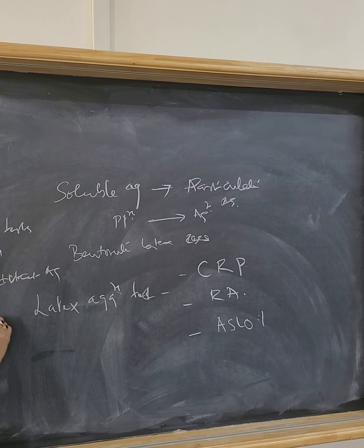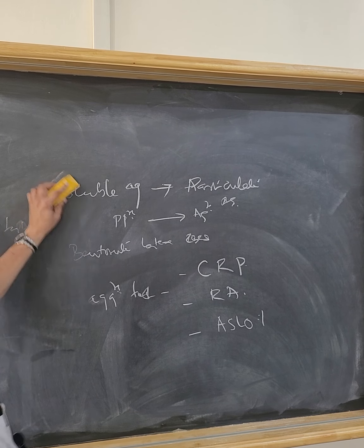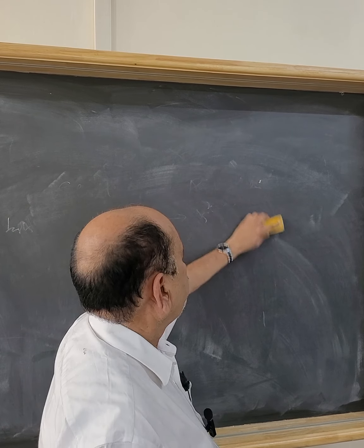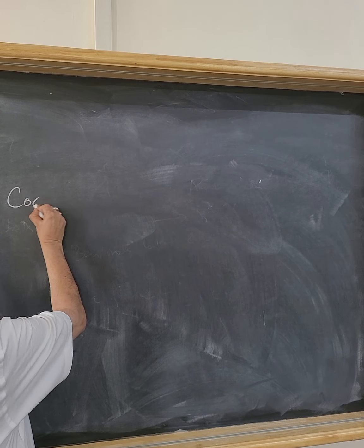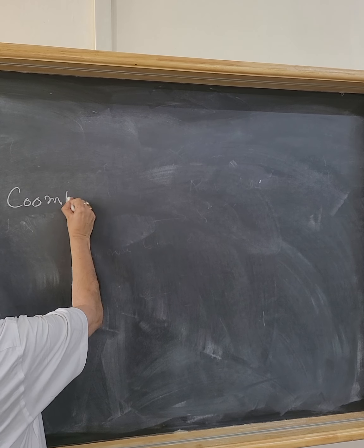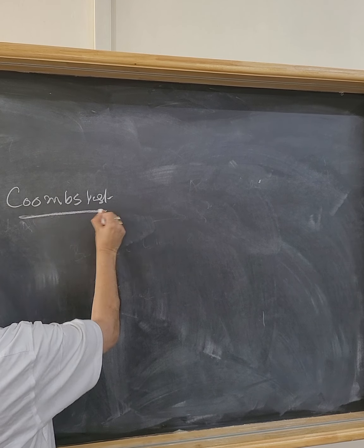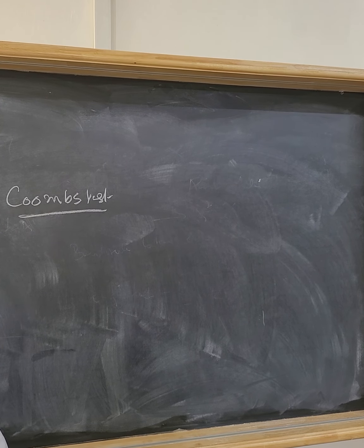The very important agglutination test we do in day-to-day clinical practice is the Coombs test. Coombs test is very important in feto-maternal compatibility.